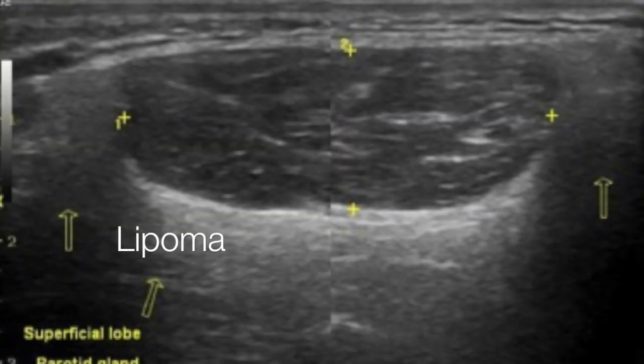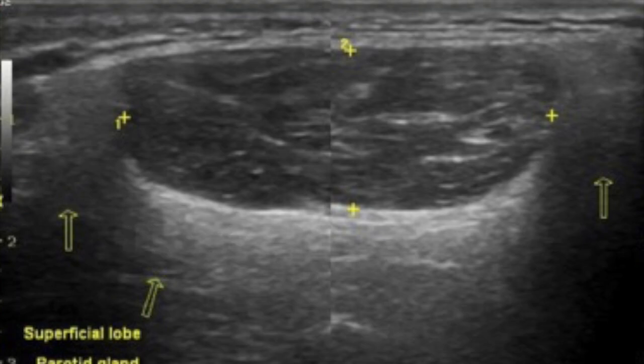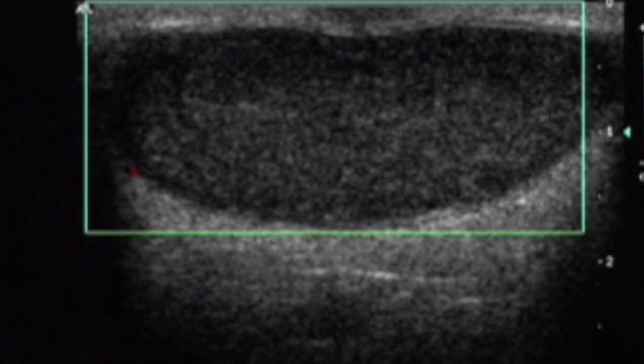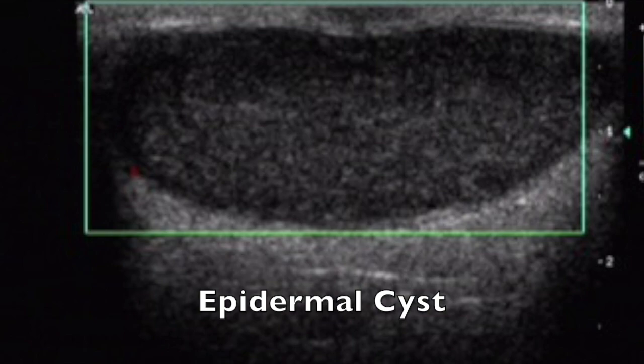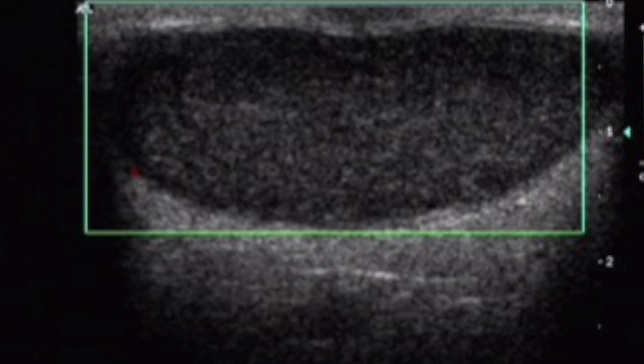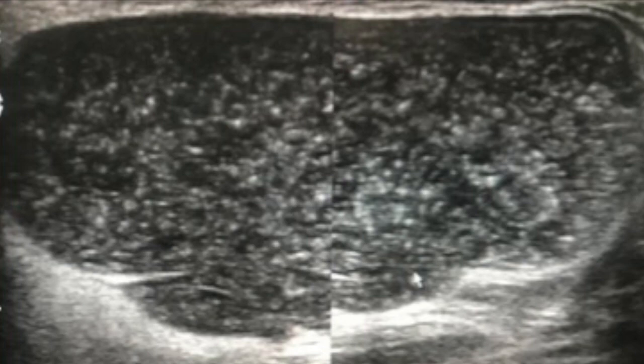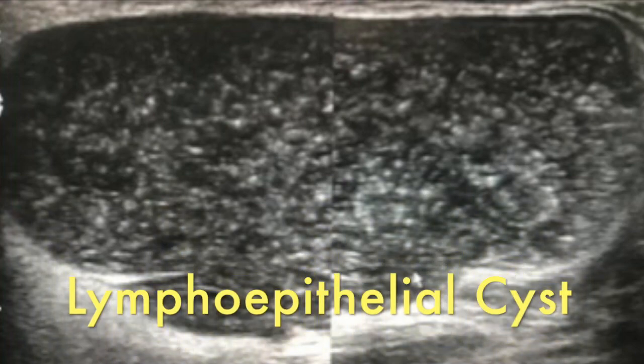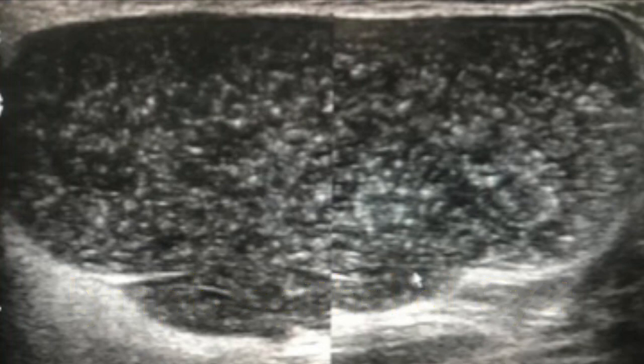To conclude with miscellaneous lesions: lipomas can occur anywhere, showing a typical fibrillar, hypoechoic, oval pattern with a feathery striated appearance — within the parotid, this is a lipoma. Epidermal inclusion cysts show a pseudotestes pattern and are hypoechoic. In the HIV era, lymphoepithelial cysts within the parotid gland are also known, appearing anechoic to pseudocystic in pattern. This proven lymphoepithelial cyst is usually bilateral and associated with HIV.